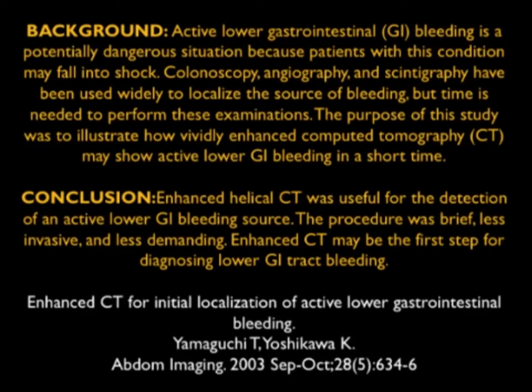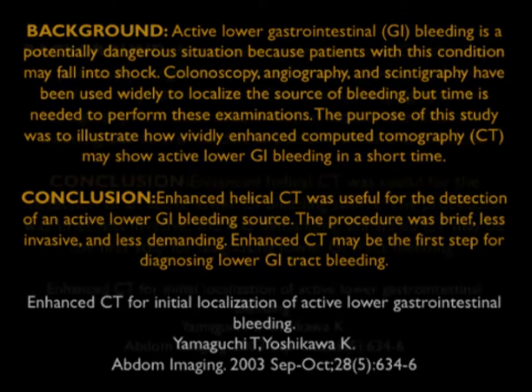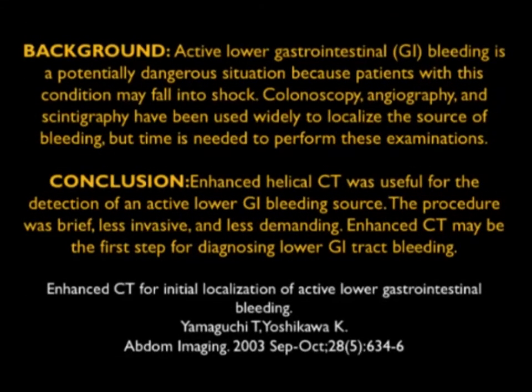The procedure was brief, less invasive, and less demanding. Enhanced CT may be the first step for diagnosing lower GI bleeding. So again, this article very nicely made the point that with GI bleeding, which is a very dangerous condition, where we're using colonoscopy, angiography, and nuclear medicine studies, perhaps the best thing to do is CT. It's a fast study. And that was in the era of 4-slice getting to 16-slice.